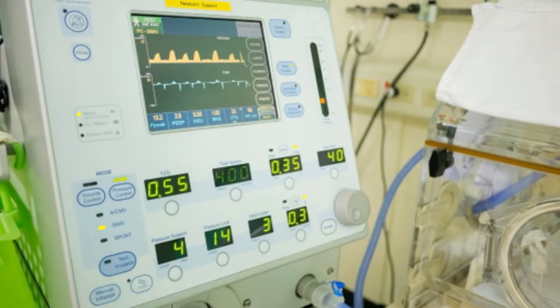Ventilators have been around for a long time. Back in the 1800s, they used negative pressure ventilators, iron lungs. I'm sure you've all heard of them. And probably about the 1940s, they started developing positive pressure ventilation. From that point on, they got all kinds of bells and whistles that go along with it. I don't endorse any particular ventilator. I will give you a broad stroke of what kinds of ventilators are out there and what kinds of modes they have, which is more important. And more importantly is how you use the ventilator.